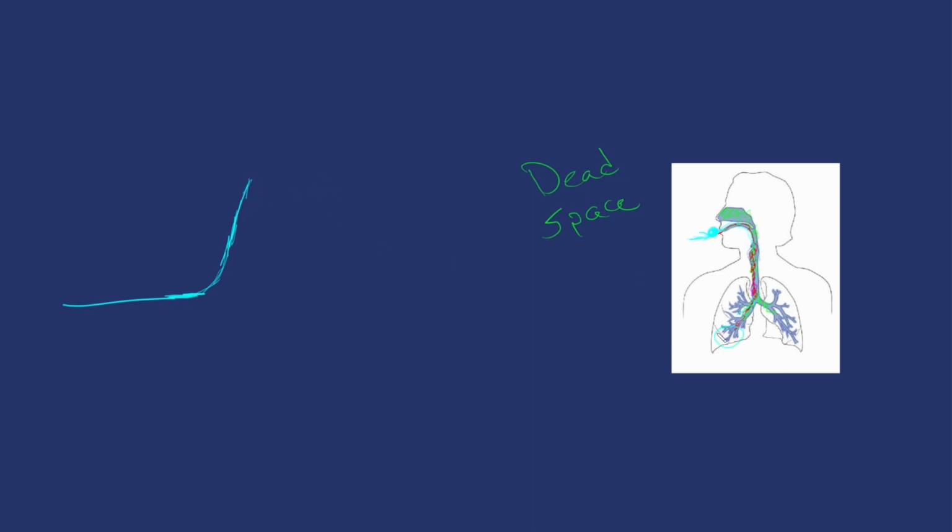And then it's going to get to a point where it about levels out. So the level that we had down here has finally mixed with all this and made its way out. So the level change here isn't going to be much different. It's going to stay at that same level. Then it's going to get to a point where it peaks out. And then we start our next inspiration. As we breathe back in, that concentration of CO2 here at the mouth is going to drop off rapidly because we're no longer getting the high CO2 that we are breathing out, we're getting the environmental CO2 that's coming in. So we're going to have this drop off, and then we just continue the cycle. And this right here is our capnography wave.